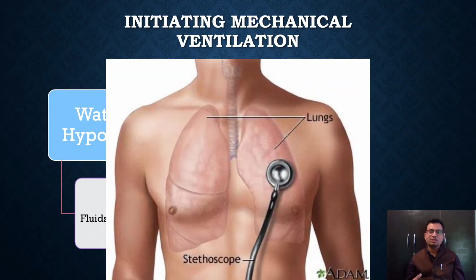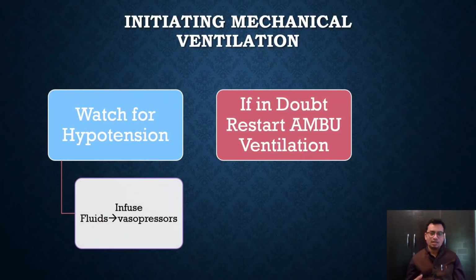That will give you a sea of information about the lungs and airways. Sometimes the ventilator may be malfunctioning, or your mechanical ventilation settings may be wrong. All you need to do is perform hand ventilation or manual ventilation and call the senior expert fellow immediately.